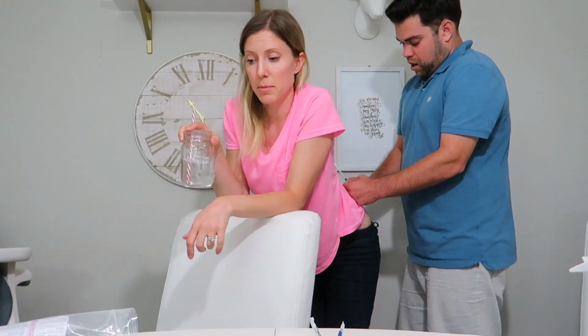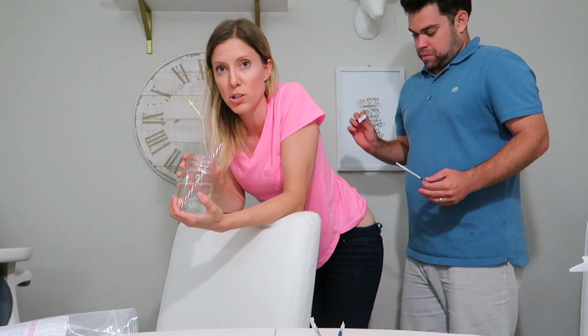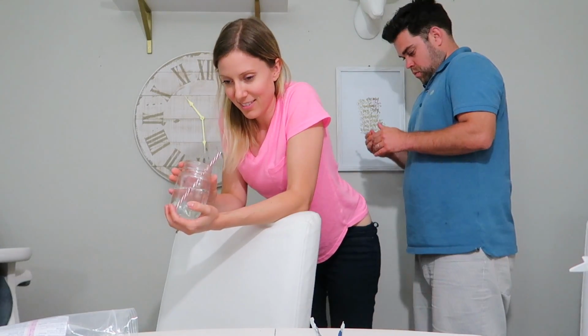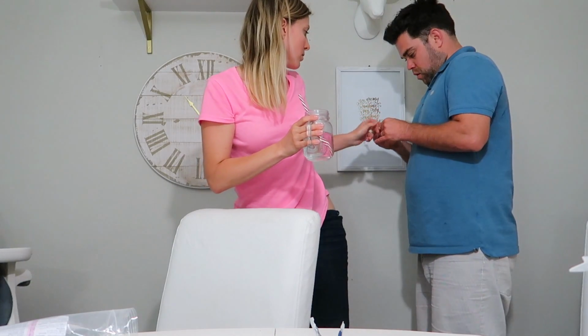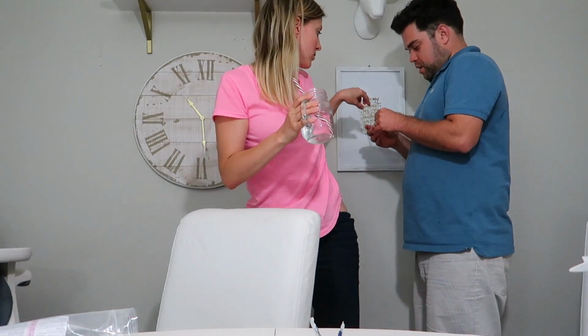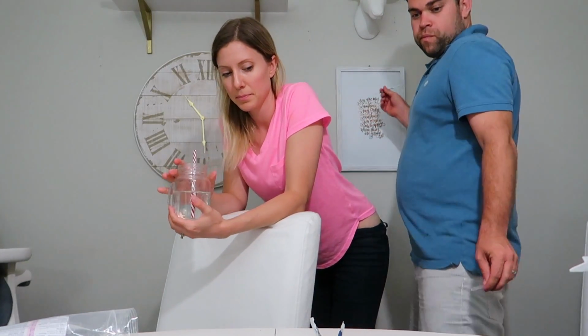Okay, so I'm gonna be focused on this. I'm standing on my other leg, which is already tired because I've been standing on it for like 5 minutes. I have a question. How does this needle come off? Oh, okay, got it. I was twisting. Don't twist. Twist it back on. I did. It's very tight, and then you just pull it straight off. Okay. So this needle is pretty much the size of a number 2 Ticonderoga pencil lead.